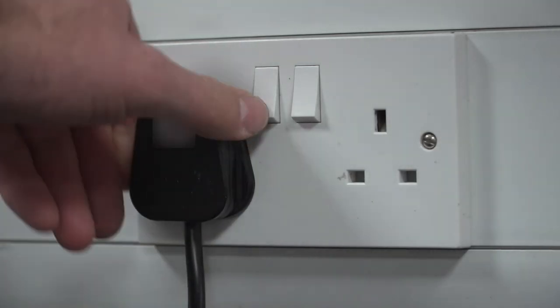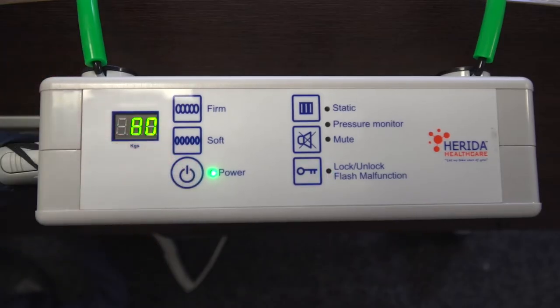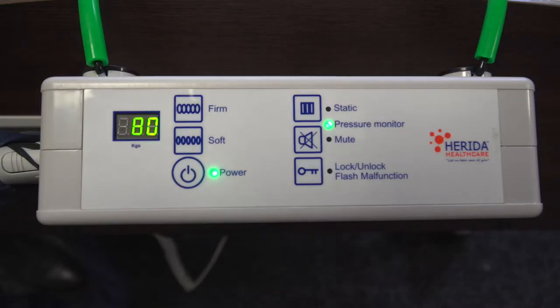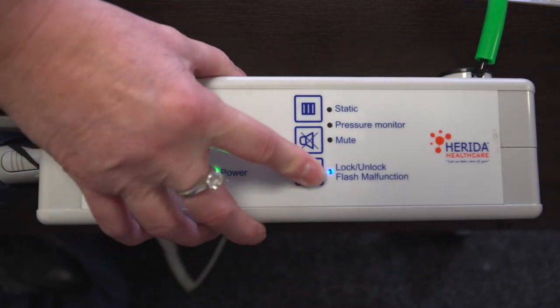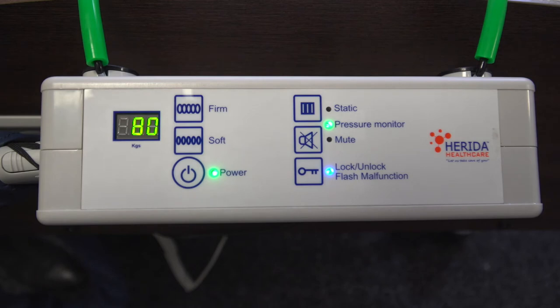Switch the pump on at the power socket and press the power button on the control panel. To set the pump to operate with the patient's weight, we need to first unlock the pump. To do this, hold down the lock/unlock button for three seconds. The pump will sound a short beep and the blue LED light will go off once the pump is unlocked.